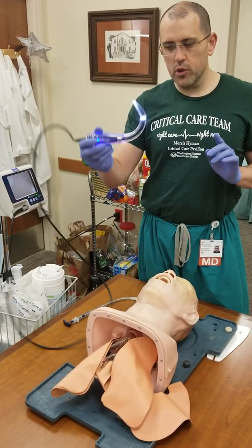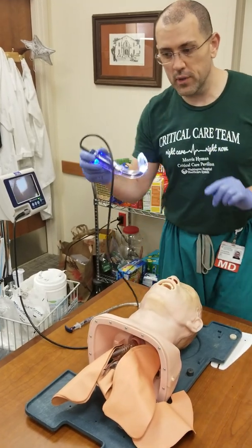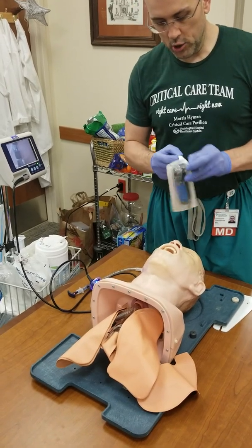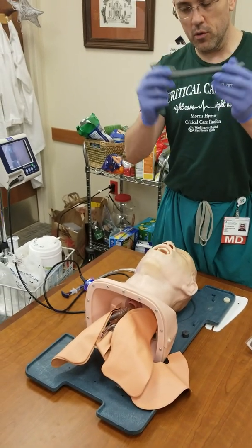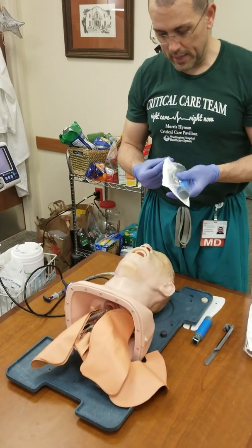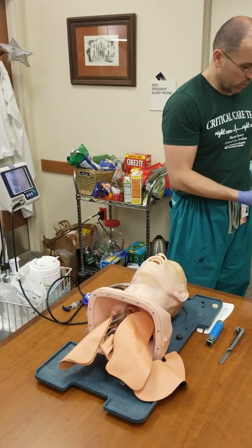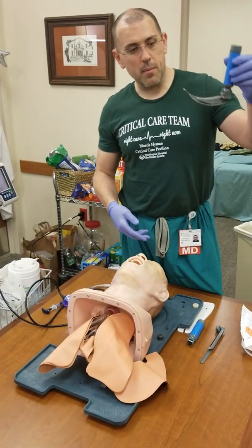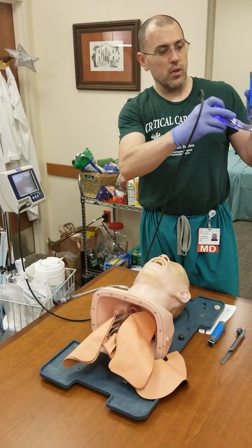Here's the GlideScope. I want to show you just how unbelievably curved this is. This is much more curved than, say, a Miller blade — which is perfectly straight — or a Mac blade. The Mac blade is indeed curved, but it's nowhere near as curved as the GlideScope. You can see how much more curved this is.